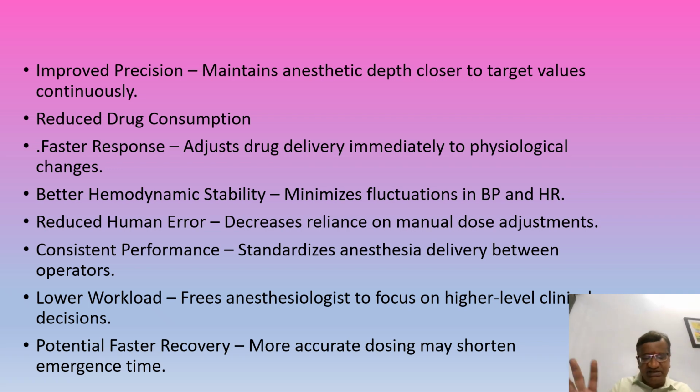Lower workload, yes, we can set up the system and go have some other case, next day case pre-op checkup. Potential faster recovery, but we should be focused. There is no non-supervised closed loop. Think of that. We just cannot go for coffee and relax.